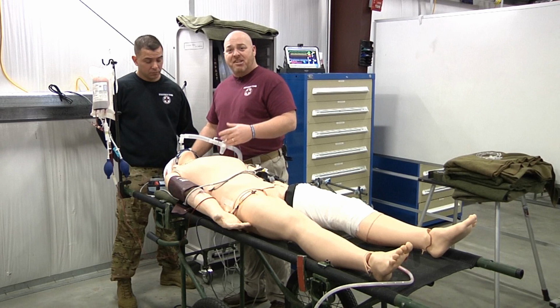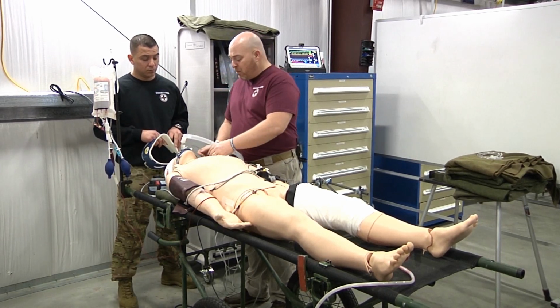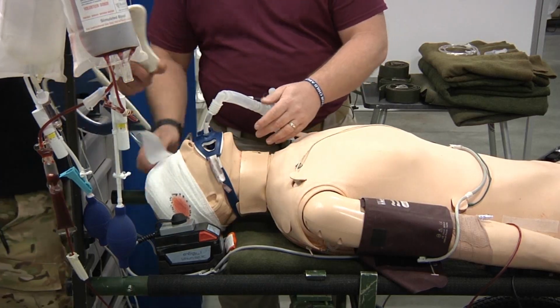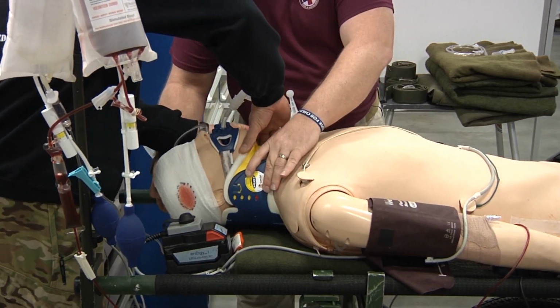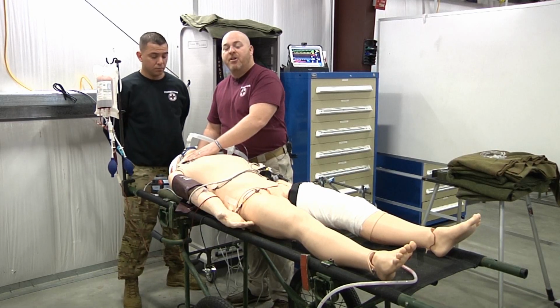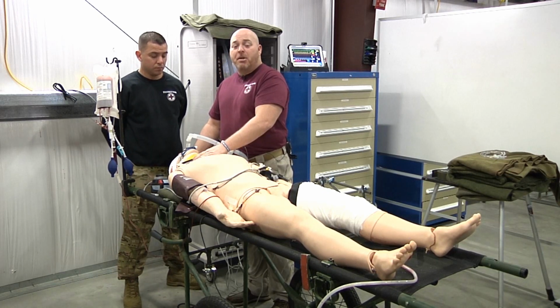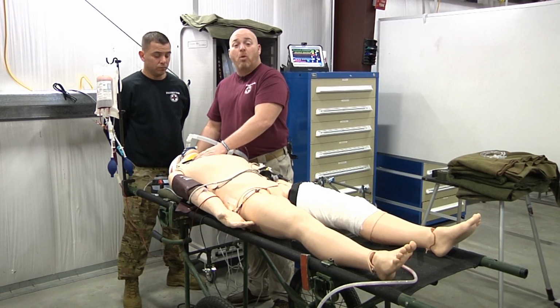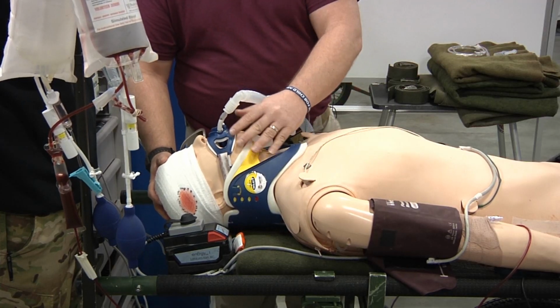Now I know that the patient's C-spine has already been x-rayed and cleared, but we're going to use the C-collar as a tool for airway security. We're going to place the C-collar, and what this does is it provides us a little bit of extra airway support, right? In the aircraft, the patient's head's gonna vibrate a lot, right? They probably have muscular blockade on, they're paralyzed, so they're not gonna have the ability to support themselves as much as they usually can. So by placing the C-collar, it will help limit that head bob.